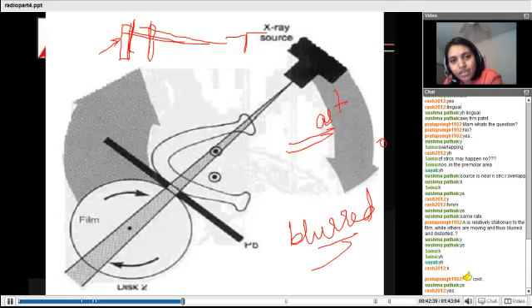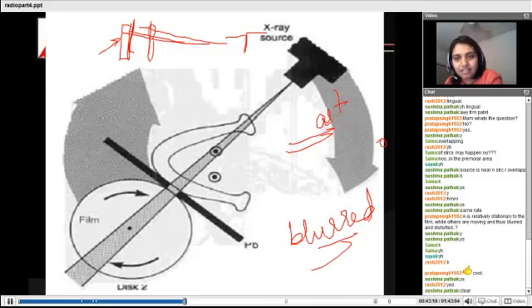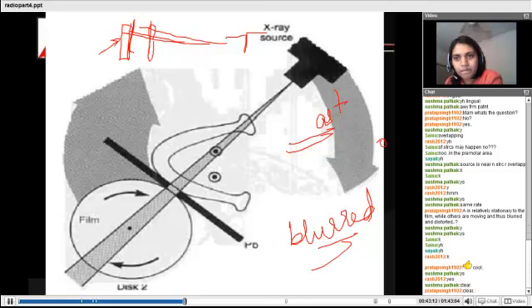So when we keep our center of rotation here, we are trying to create the scenario such that our X-ray sweeps fast on this particular area and it sweeps synchronously on this particular area, so this is recorded. Getting the point? When we shift it over here, the opposite happens. Confused or clear? I know it's a little confusing as far as the OPG imagination is concerned. Okay?